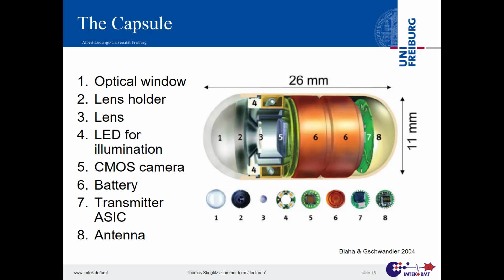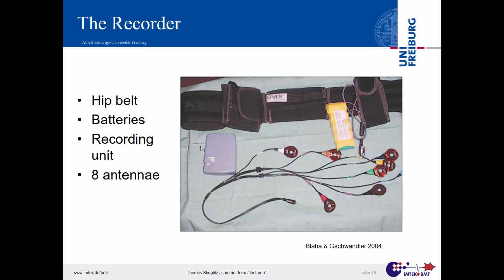So a lot of standard things that are really good for harsh environment systems always come with a high temperature load. Laser welding, for example. It's really cool, it closes everything, but if you do that on such a capsule, you would destroy everything that's in. And that means you have to take standard assembly here, standard soldering, that you can also scale up then for manufacturing, and have to find out what plastic material can I take that survives 48 hours, which comes probably already with a certificate that somebody else checked out, that it doesn't destroy anything, that stays stable and is not toxic.